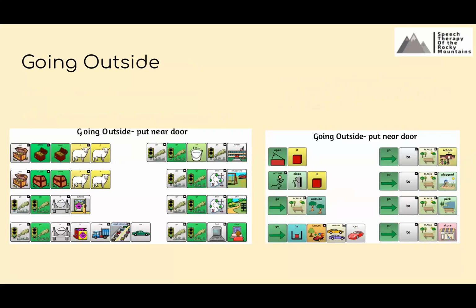Here are boards, and again, these go with two different devices. You could make your own for your child's specific vocabulary, but I like to tape this next to the front door.